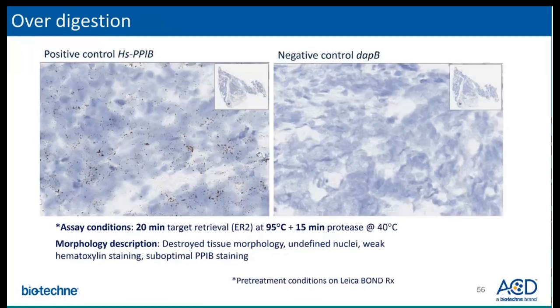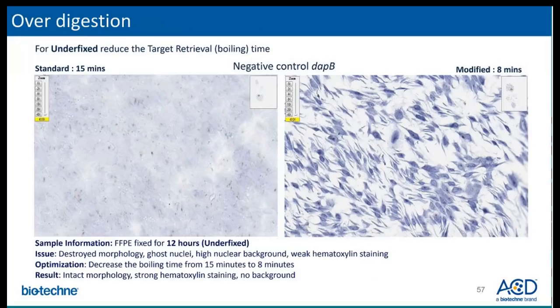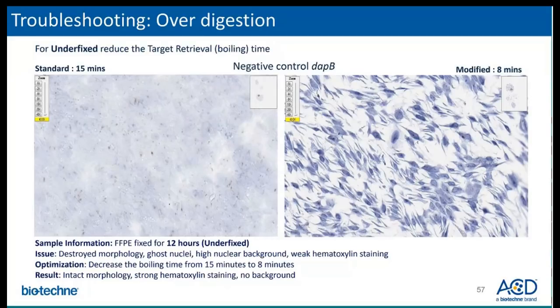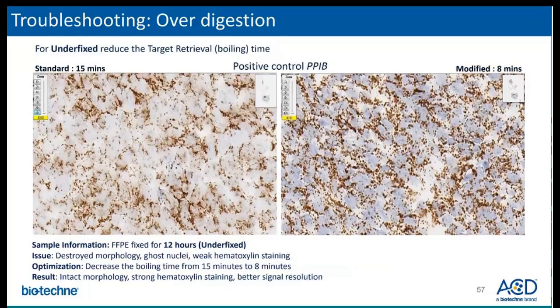As compared to the last slide, this dataset shows tissue that has been over-digested, in which the nuclei are now undefined, using suboptimal tissue morphology, and the PPIB staining is slightly weaker than expected. Here, the target retrieval time was reduced to eight minutes, and that improved the morphology and eliminated the background seen in the negative control. There is better morphology and better signal resolution using the modified target retrieval time, as shown with the positive control probe PPIB.